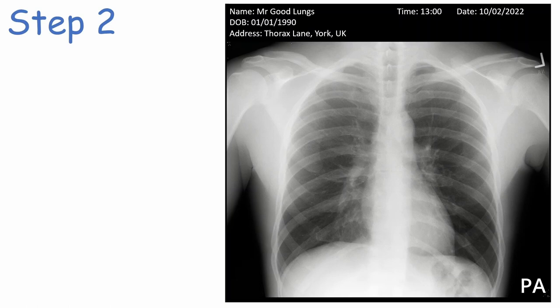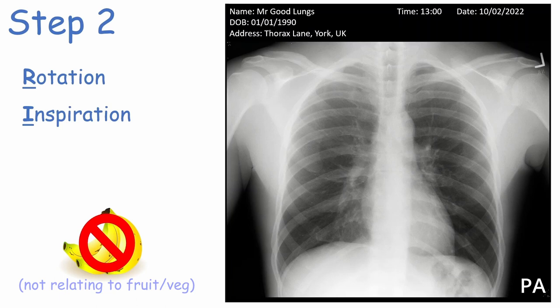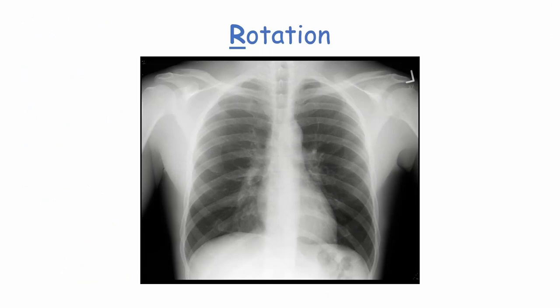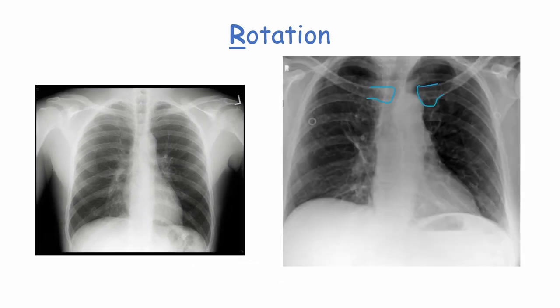Step two is to assess the image quality using the mnemonic RIPE: Rotation, Inspiration, Projection, Exposure. For rotation, this chest X-ray is not rotated and we can tell because the medial tip of each clavicle is equidistant from the spinous process. A non-rotated chest X-ray will also show all the vertebrae stacked neatly in a vertical line. If a patient's upper body is twisted or leaning, the chest X-ray will appear rotated, which can make the trachea appear deviated when it might not be.